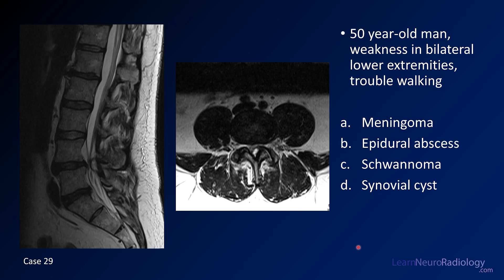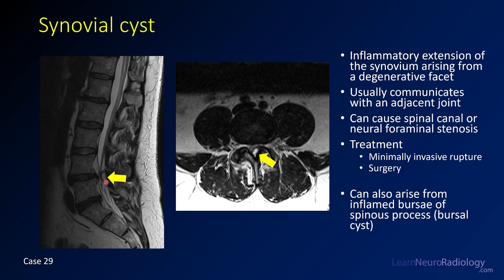Case number 29: a 50-year-old man with weakness in bilateral lower extremities and difficulty walking. Sagittal T2 and axial T2 MR images. Choices are meningioma, epidural abscess, schwannoma, or synovial cyst. The answer is synovial cyst. You see a cystic lesion along the posterior margin of the spinal canal with a dark T2 rim and central T2 hyperintensity. It has a tail connecting to a left-sided degenerated facet joint and is asymmetric to the left, causing narrowing of the spinal canal. If off midline and connected to a joint, call it a synovial cyst; if midline near the spinous process, consider a bursal cyst.